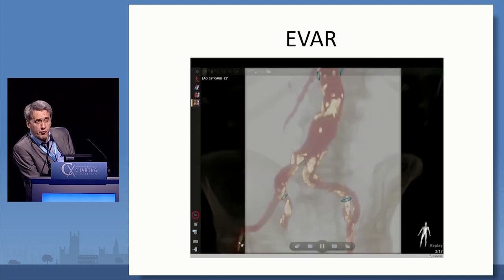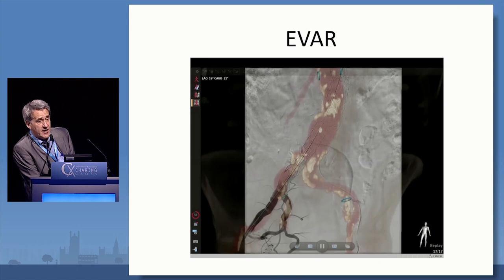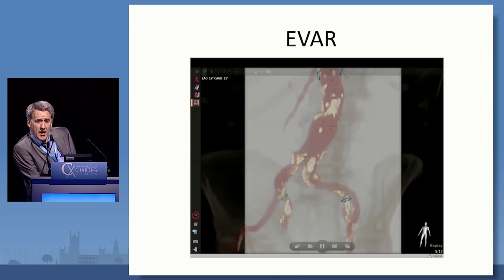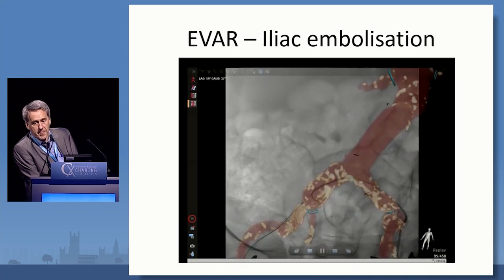One of the other problems that might occur is, of course, the fact that when you insert rigid devices, the iliac anatomy, certainly when it's tortuous, is changed. This is true, for sure. But in our experience, what we saw is that actually the iliac bifurcation is a very stable place. I was a bit amazed by that, but the iliac bifurcation itself, so the point that's important for us, does not change a lot, probably because it is rather fixed in the pelvis.